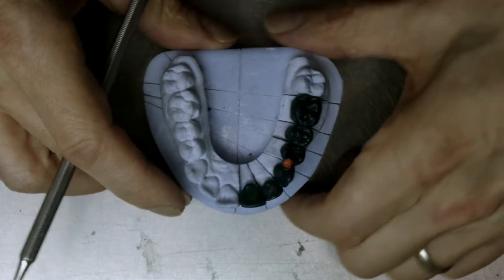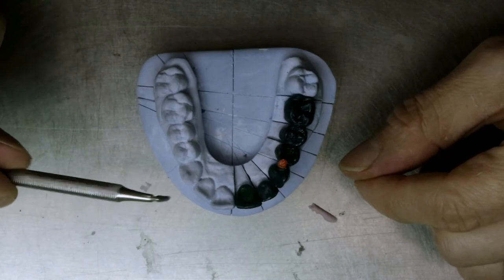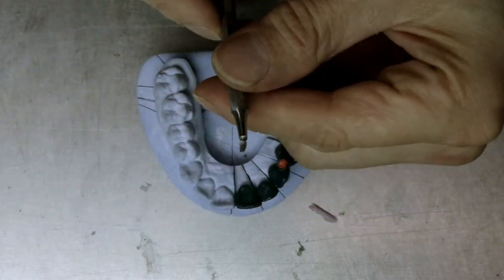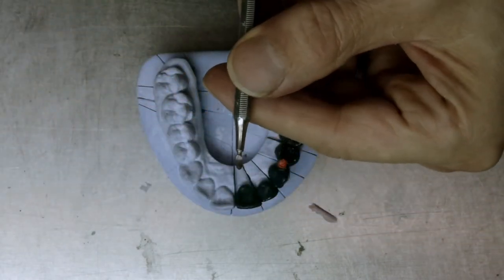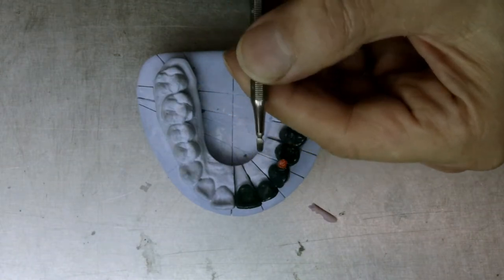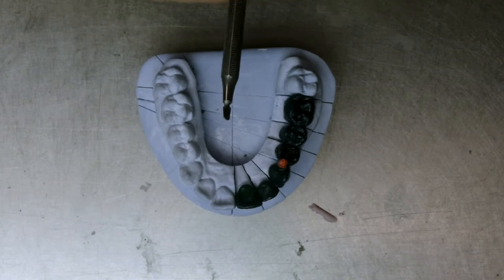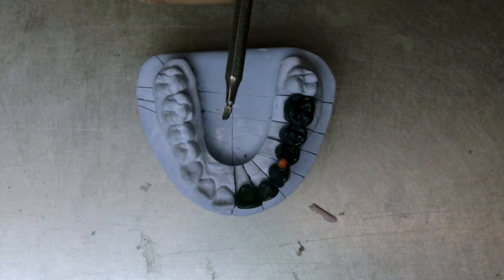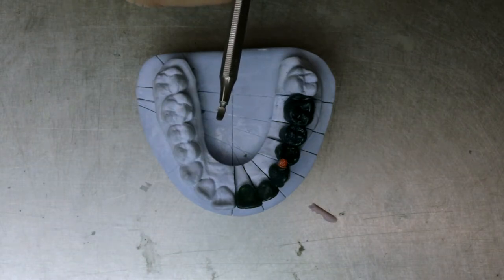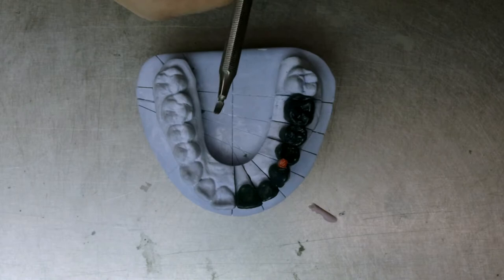So to cut back, we're going to use a tool like this — it could be anything, but it should have a rounded tip like such. This one happens to have a small one and a larger one. This I made myself, and you can do the same thing if you have a broken instrument. All it is is a little bit of a grinding stone or a disc, and you polish it up with a white rubber wheel, and you have yourself an instrument.